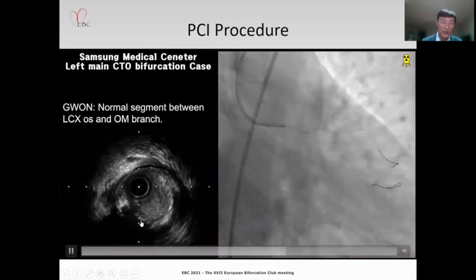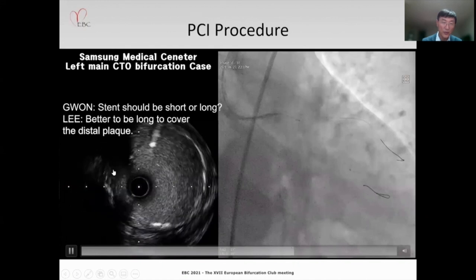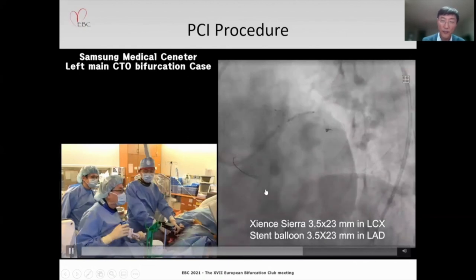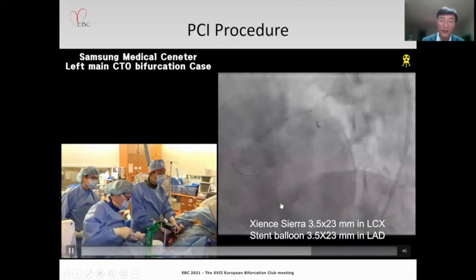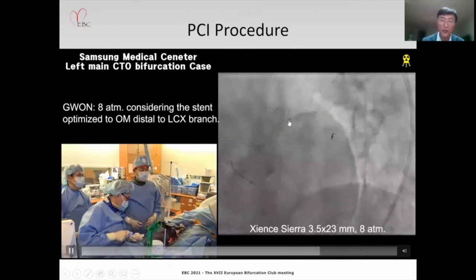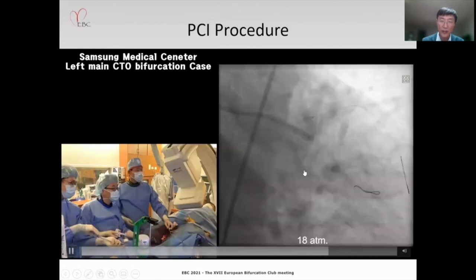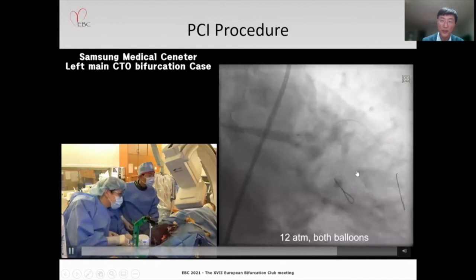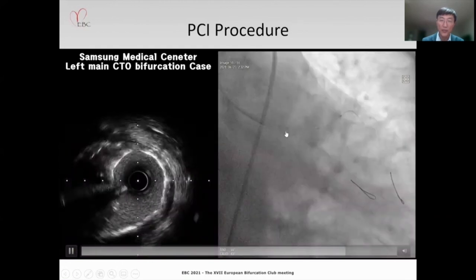This is IVUS examination from here. Actually, this is the ostium of circumflex. The wire travels in the true lumen. So the next step is very easy. So I tried the TAP technique with the Xience Sierra 3.5 by 23 millimeter in the circumflex with the balloon and stent balloon in the LAD. And the implant with low pressure, considering the small size of the obtuse marginal, pullback, higher pressure, and finish with the moderate pressure kissing ballooning.